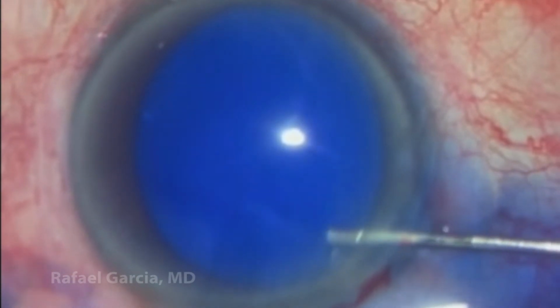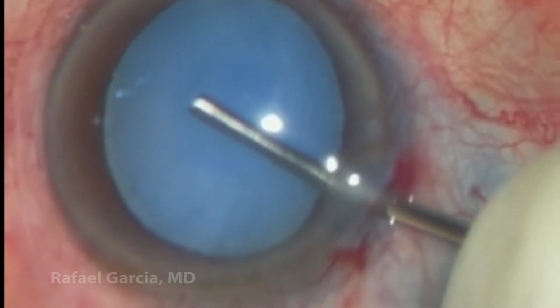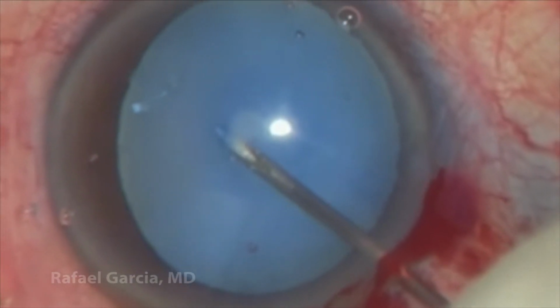Some trypan blue dye is injected and then washed out, and now a good amount of cohesive viscoelastic is used to really inflate and pressurize the anterior chamber.